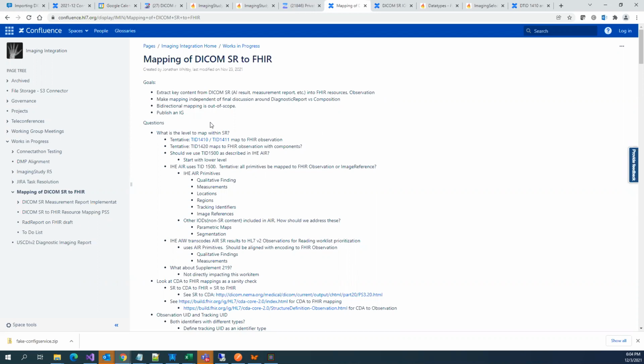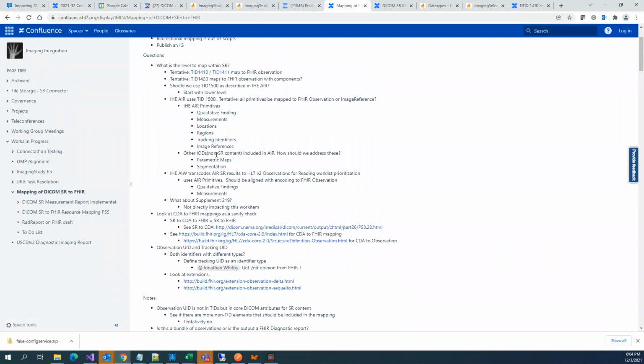He would be presenting it in the next work group meeting, on December 10th or so. He asked if I or anybody could join that meeting. So this is completely a standard thing? It is. We are very early, actually contributing to that IG. That was also one of the intentions: we will review their IG and contribute. How do you contribute? You already implement.